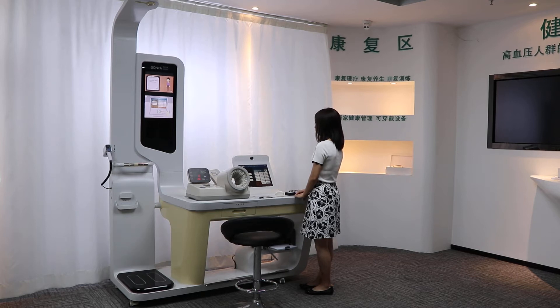It can measure height, weight, BMI, body composition, temperature, blood pressure, blood oxygen, waist-hip ratio, ECG, blood lipid, blood glucose, uric acid, cholesterol, and give a final report.